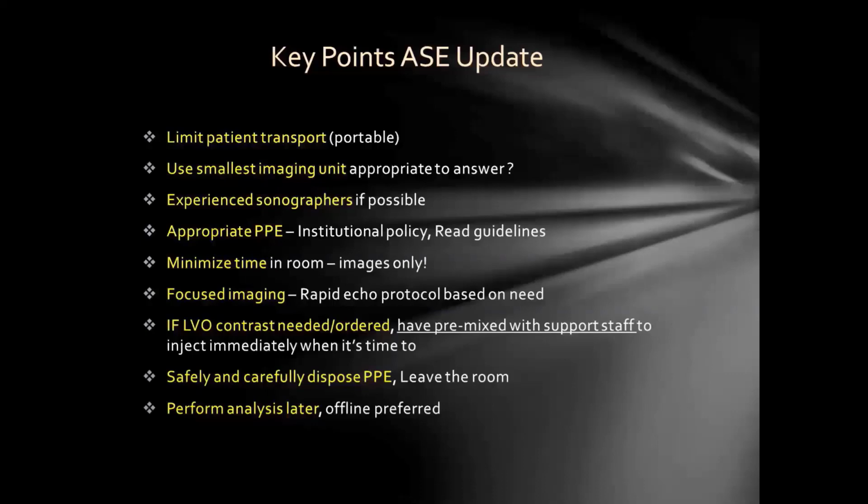If possible, there are obviously different staff and different rotations. You want the most experienced sonographers who can scan efficiently, accurately, and quickly in these types of patient rooms if possible. But obviously this is going to be variable based on what tier site they are, tier 3 or tier 2, and where it's located. So just be the person that you feel confident can go in and get what is needed as efficiently and accurately as possible, and you're the right person.